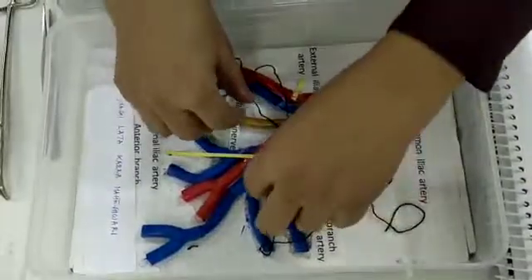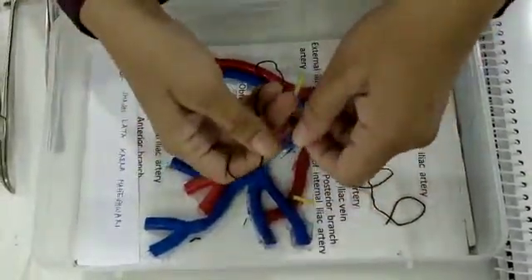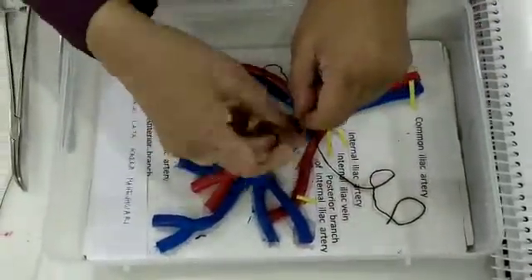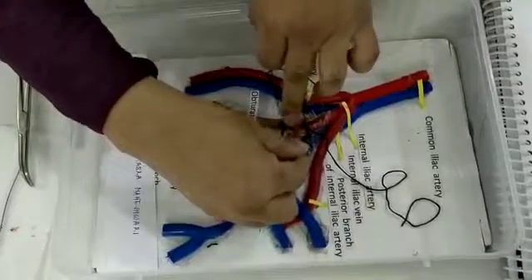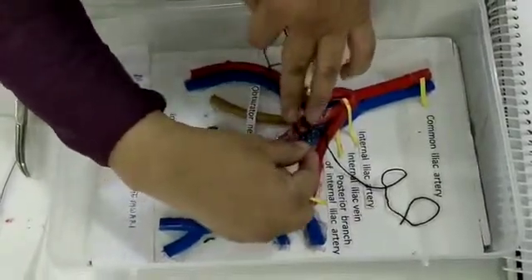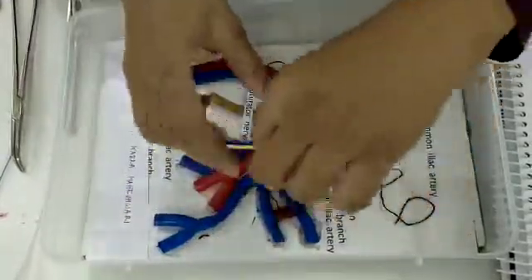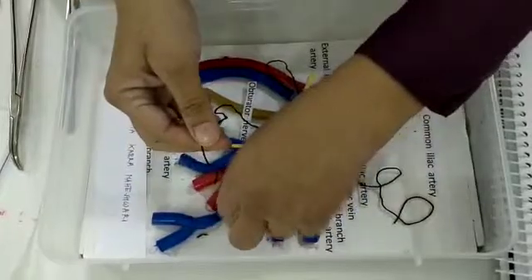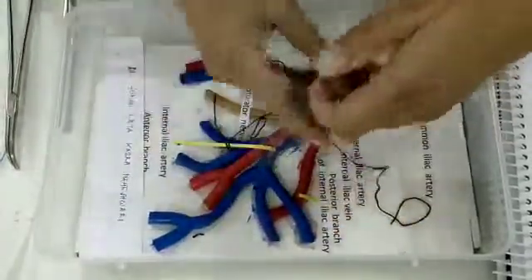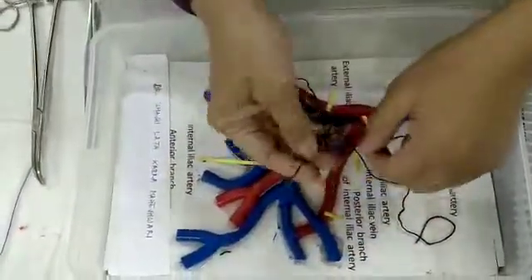In a similar fashion I take another thread. First knot, going up to the artery with my fingers, never pulling the artery, and placing the suture like this. The artery has been ligated. This is the second suture, second knot, and third knot.